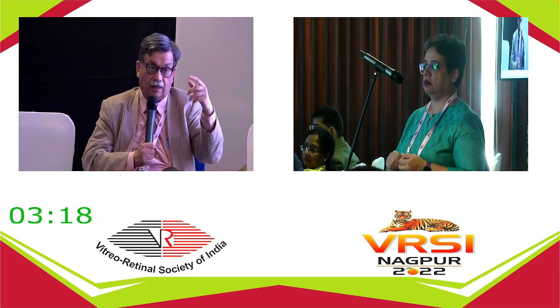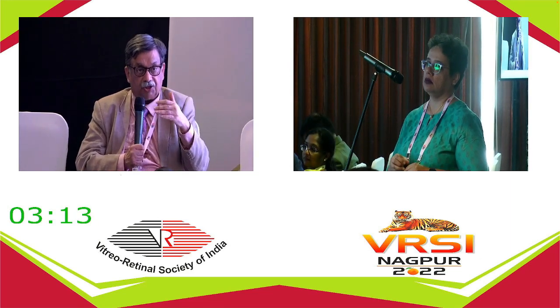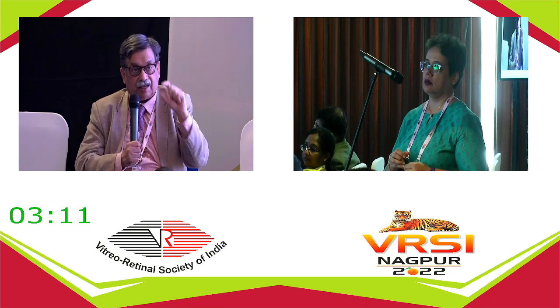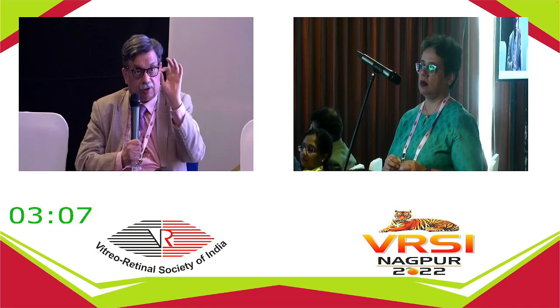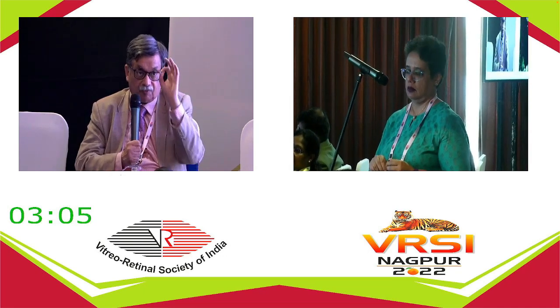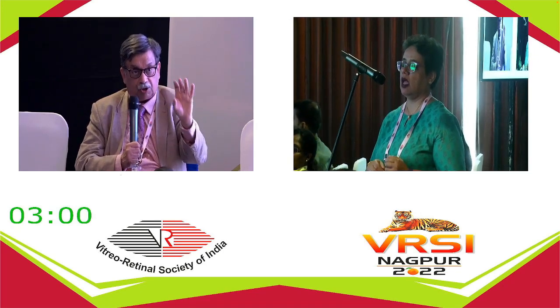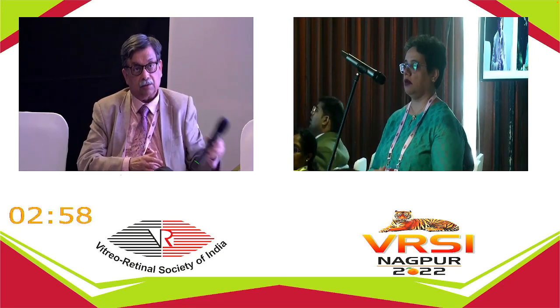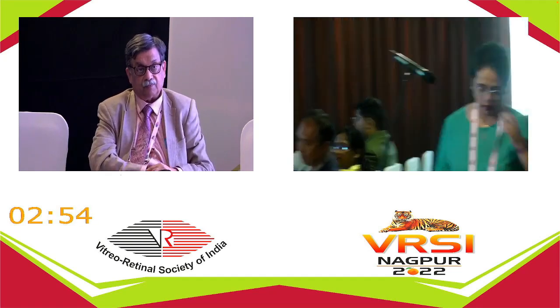Because rather than... I mean, you do everything. But if you want to make it even more sluggish, what is inciting it is the light. So if you decrease your background light so that you have just the minimum light needed for visualization, and then use the laser, possibly, the movement would be less. Possibly.